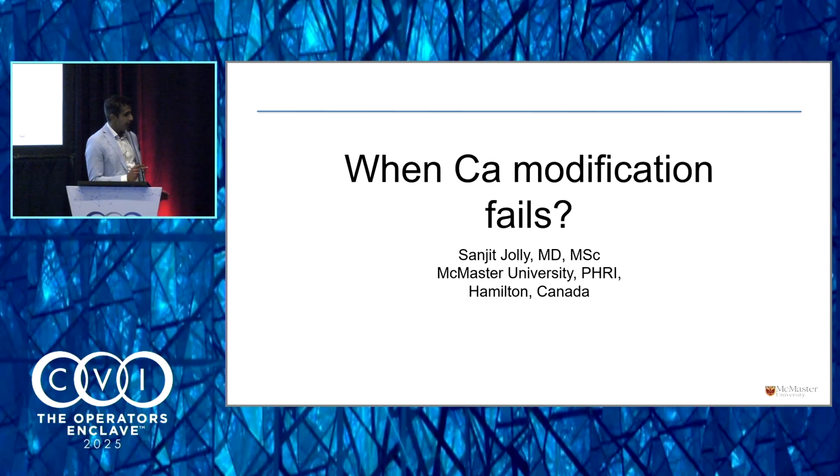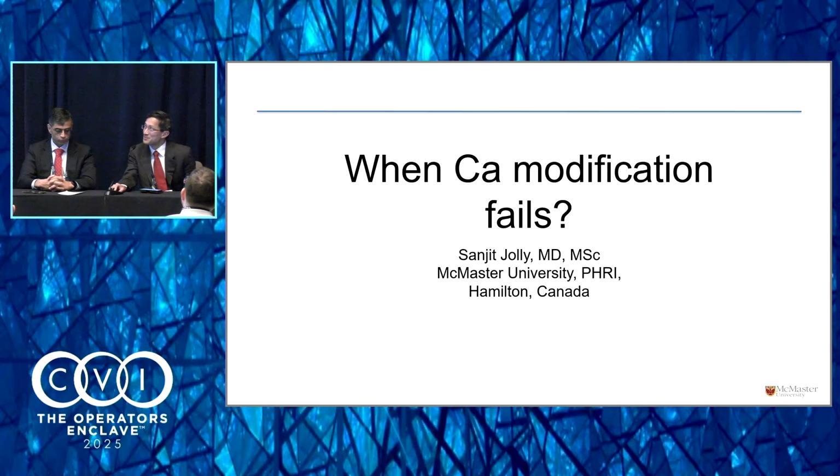So I think it has to be used carefully, and we always think that, you know, this doesn't require any training. What I would say is that we image these cases and we specifically undersize. Occasionally we'll go one-to-one, but for the most part we undersize, and you get excellent areas with this technology. Specific to the calcified nodule, one might think that that could be at risk of perforating because you're dilating in one direction.